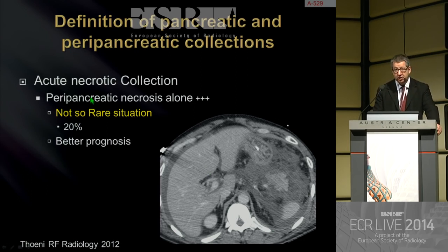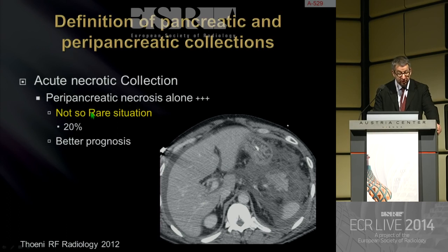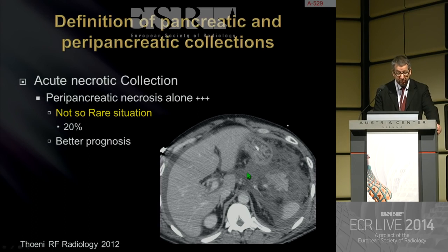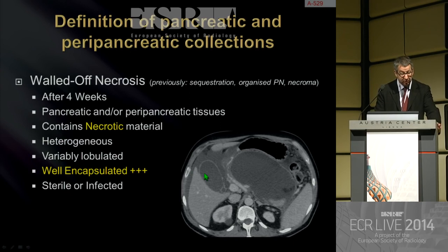A third situation, very important to emphasize because it still creates confusion: you can have acute necrotic collection in necrotizing pancreatitis with only peripancreatic necrosis. It is not so rare — it accounts for around 20% of situations — and it has a better prognosis compared to necrosis present in both the pancreatic parenchyma and peripancreatic area. Here is an example with normal enhancement of the pancreas but a large amount of surrounding fluid.